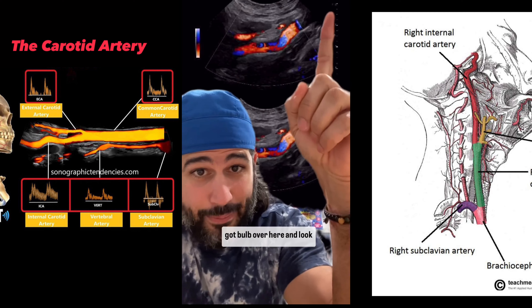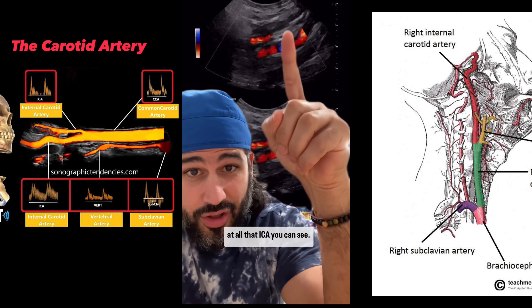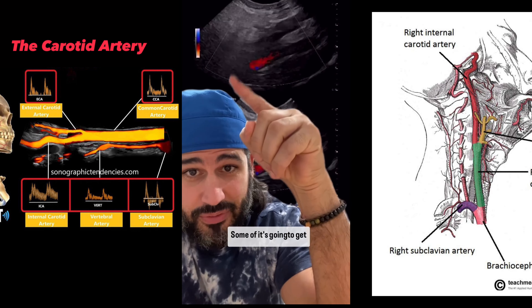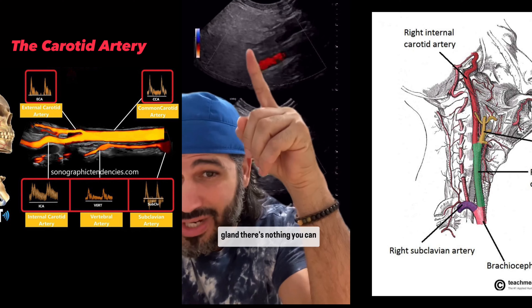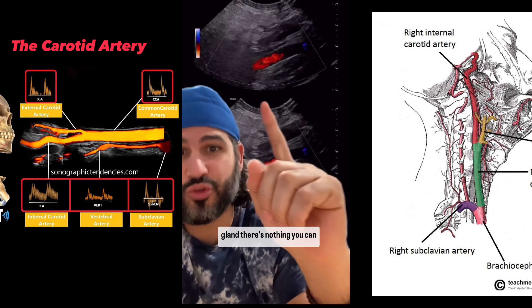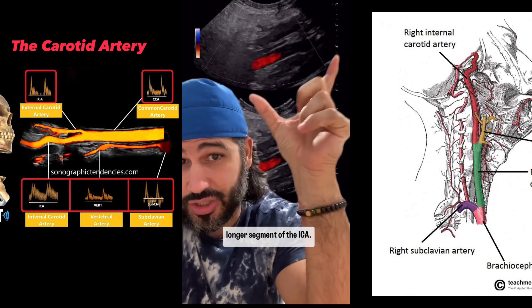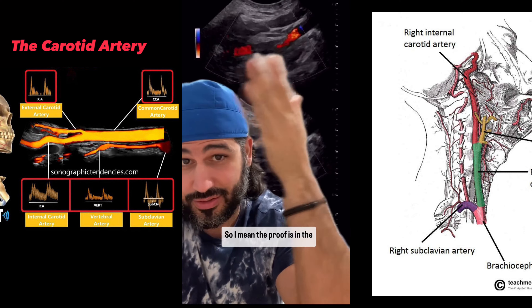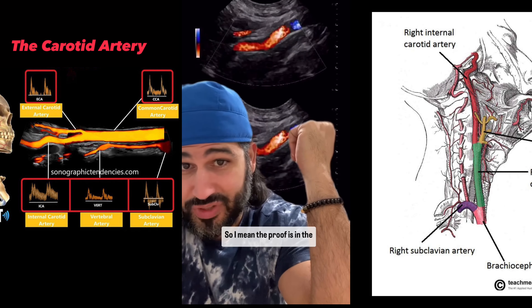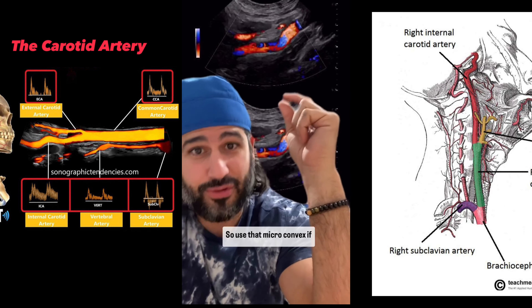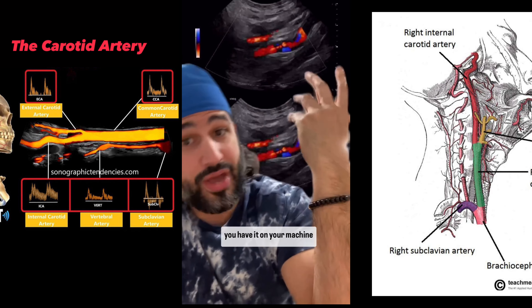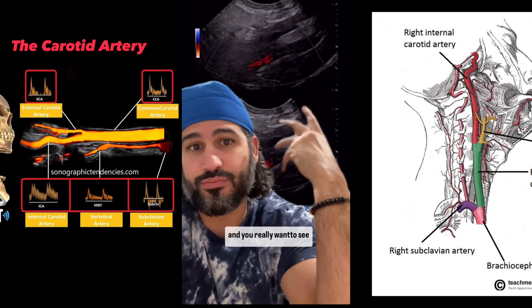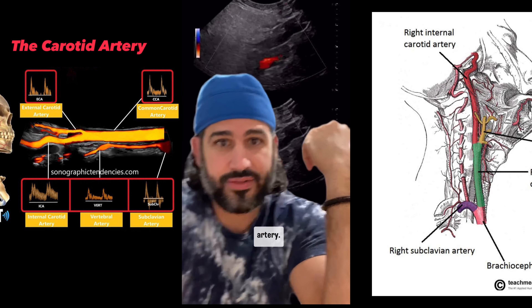Now with the micro-convex, you've got the bulb over here — look at all that ICA you can see. Some of it's going to get blocked out once you reach the parotid gland; there's nothing you can do about that. But you're getting a larger, longer segment of the ICA. The proof is in the pudding — use that micro-convex if you have it available and you really want to see more of the internal carotid artery.